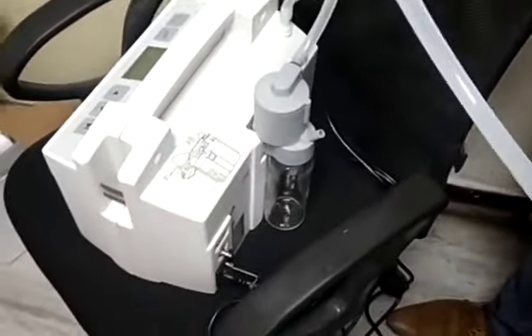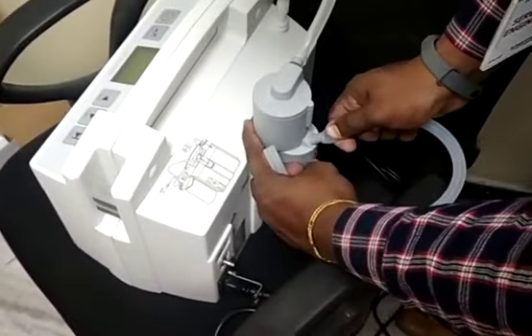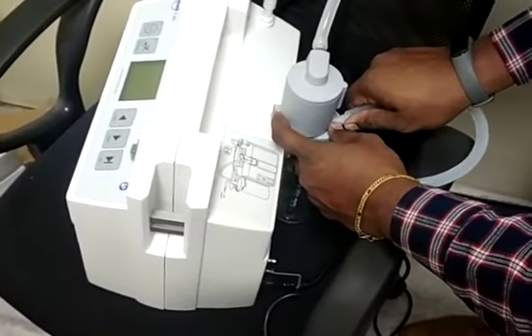This is the lengthy tube to connect between the safety jar and the main jar. We are going to connect this tube here. Just press it inside and it will be connected.